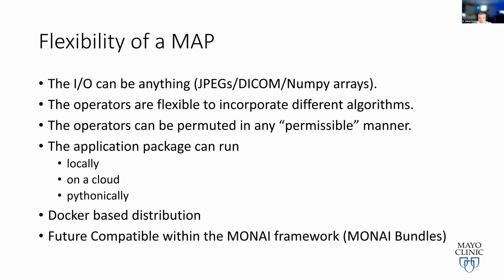And you can distribute it as a Docker container. The platform will create your Docker container for you. We have packages. If you wrote your code Pythonically, you can take that Pythonic code and create a Docker container out of that. You can deploy it anywhere you like to. And the idea is features are all compatible with the MONAI framework.